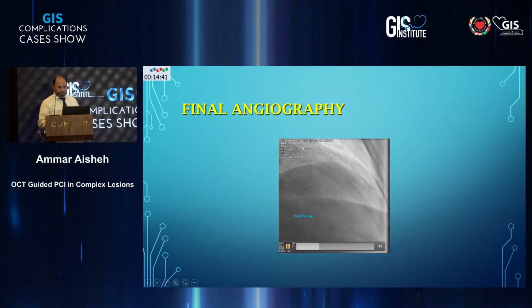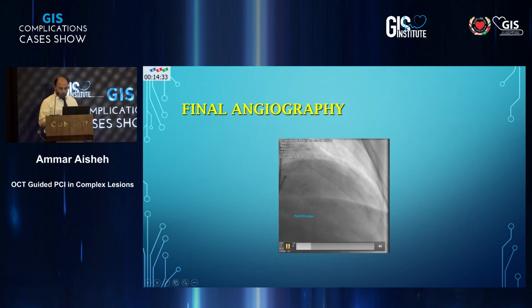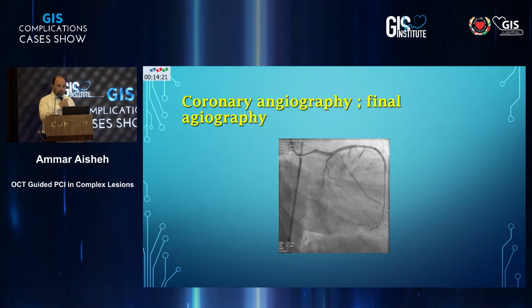This is the final angiography post-PCI to LAD. This is the final result. As we see here, there is also a tight lesion in the Ramus or high OM.